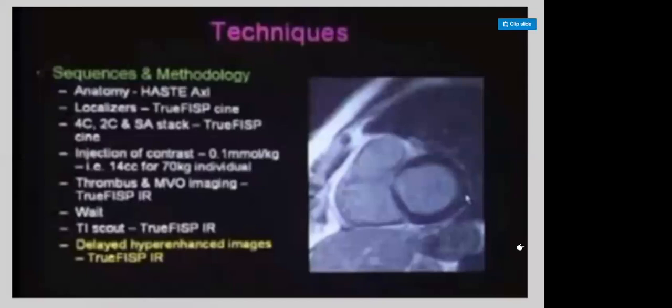Can anyone recall, whenever you're trying to comment using the cardiac MRI, what are the functions? How is a cardiac MRI reported? Can anyone recall for me? It mainly talks about the perfusion, sir, to the myocardium. Good, good, wonderful, and? And viability. Good, nice.